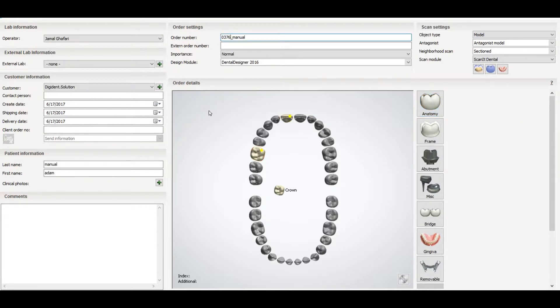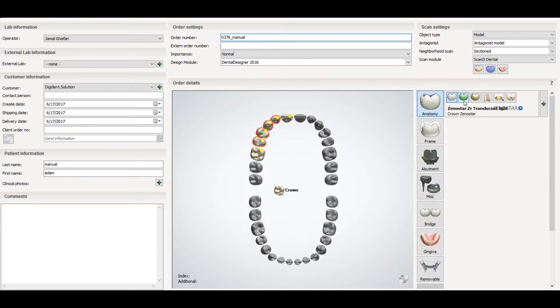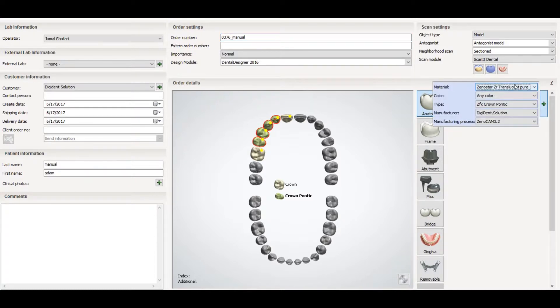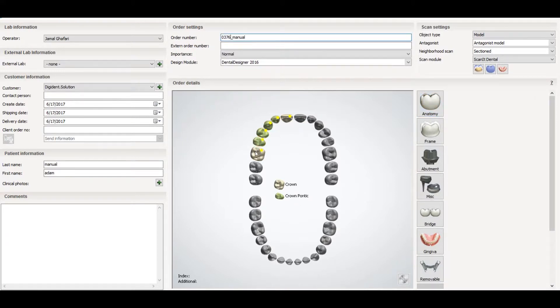Now if you want to select a bridge, you will select the abutments as full crowns and the pontic area. For the pontic, select the relevant teeth, go to the anatomy section, and select the pontic option from the crown section. Then you will select the material and the manufacturer process. After that, select all the crowns and make them a bridge.